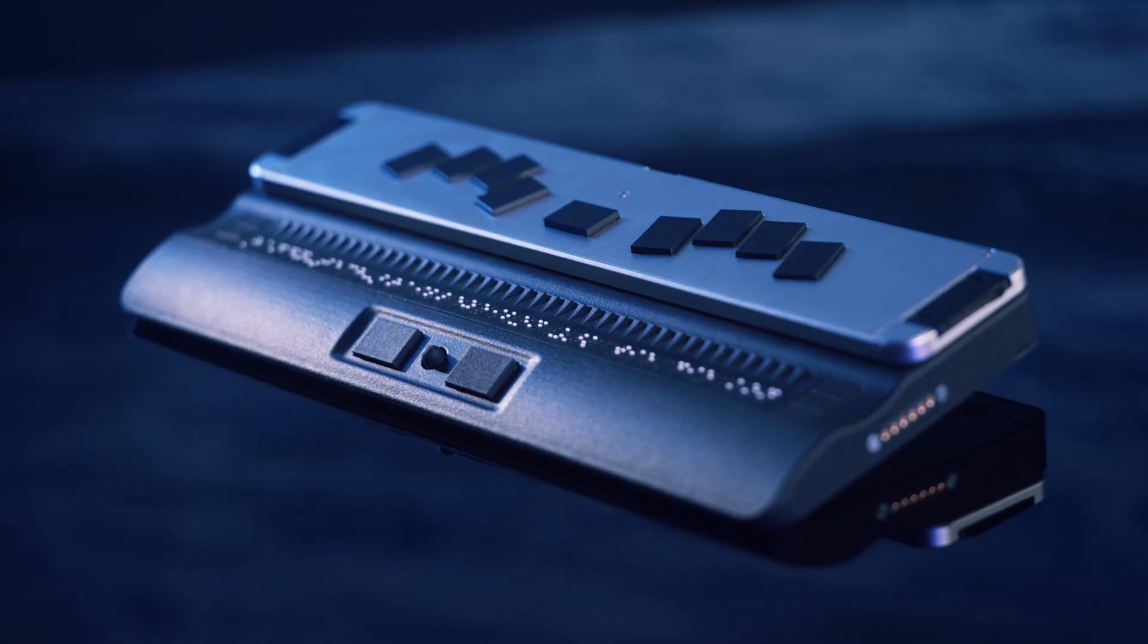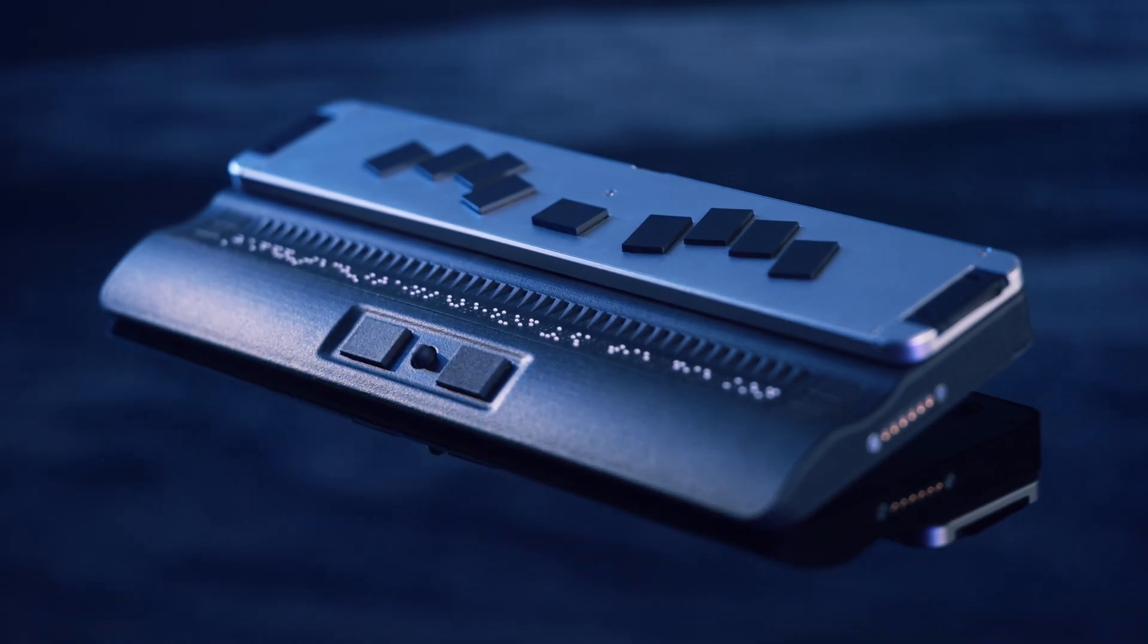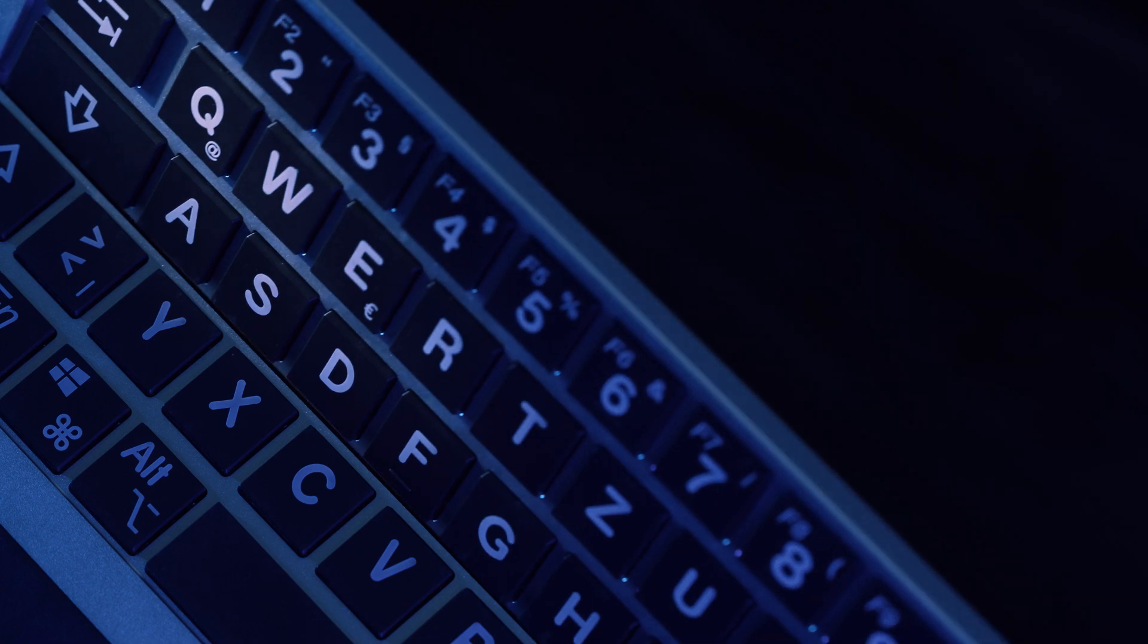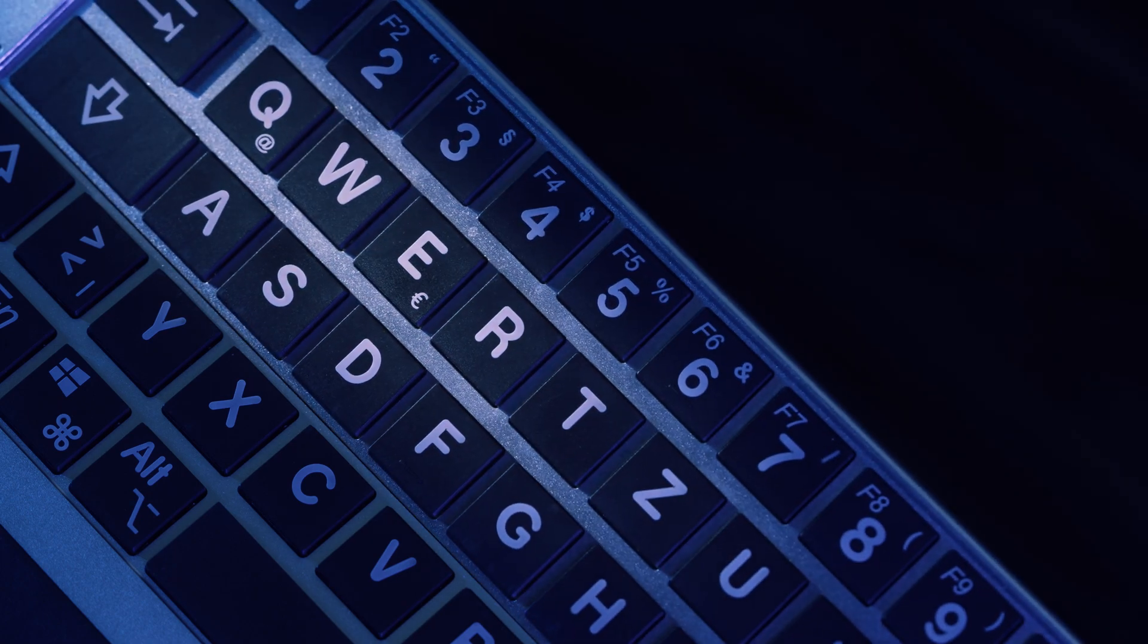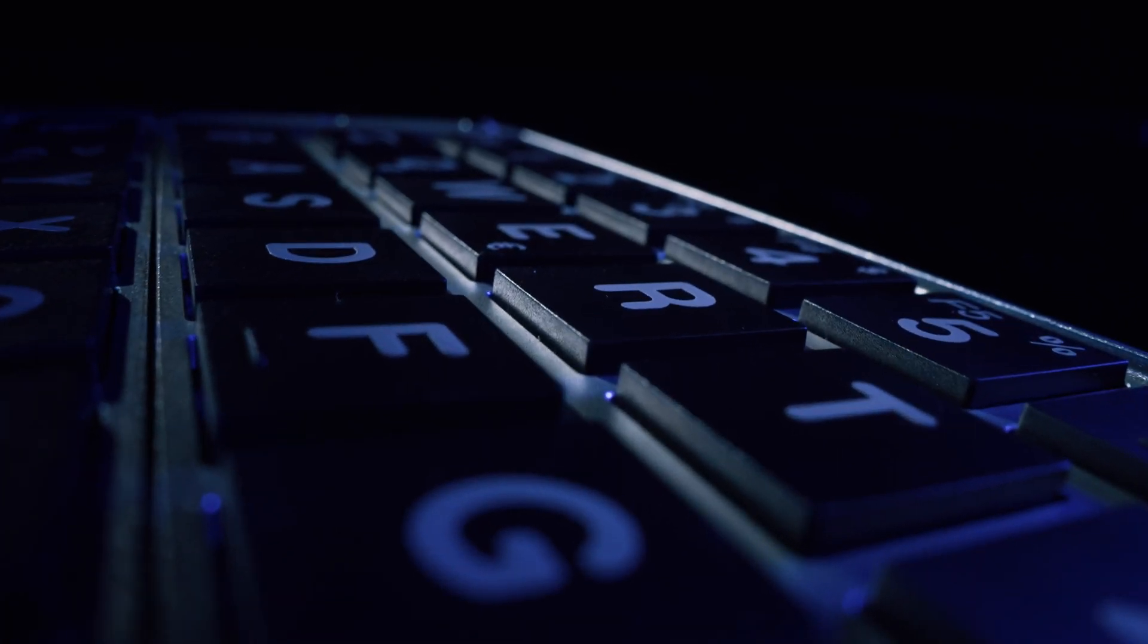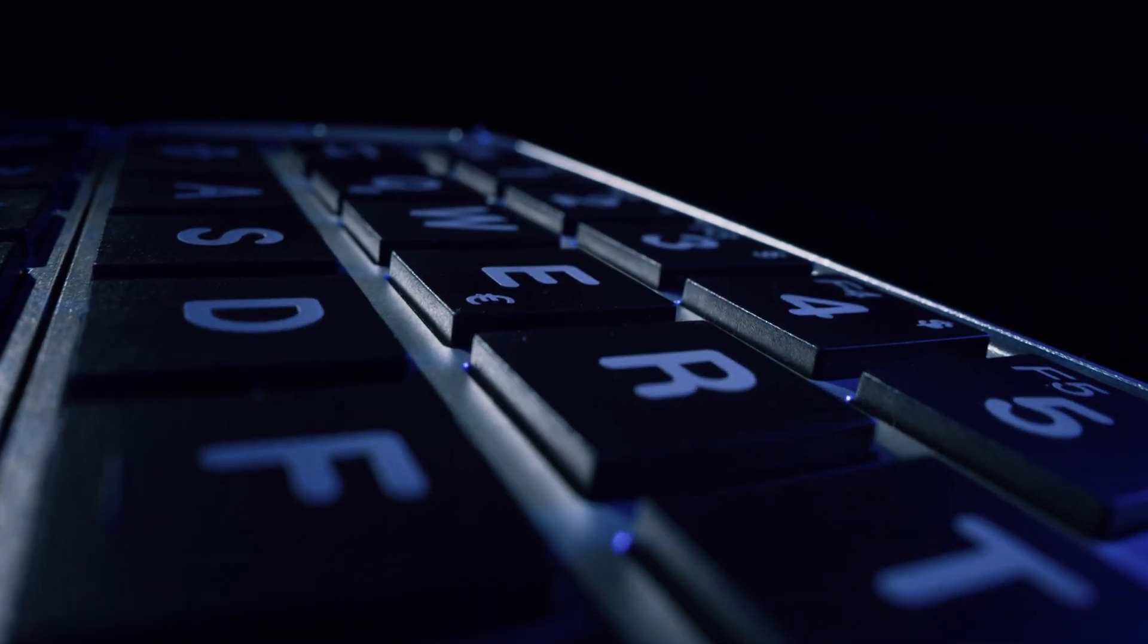The ultra-slim, multifunctional, two-in-one folding keyboard takes Braille to a level you've never seen before.